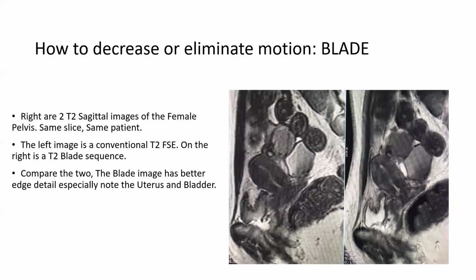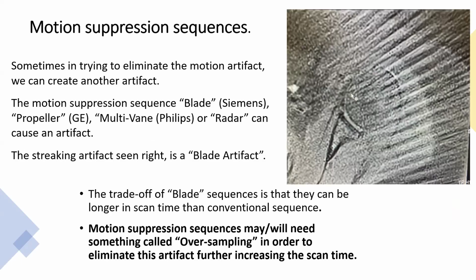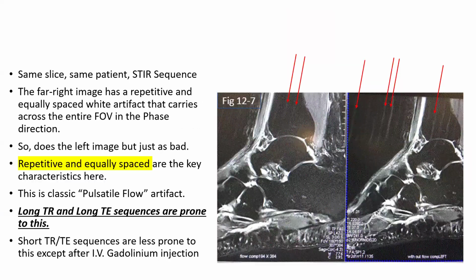All right. Some of the trade-offs for radial scanning is higher RF, because you're overlapping, you're repeating a lot of the lines of k-space. So there's more RF. Here's a blade artifact. Maybe you guys have seen this before, maybe you haven't, but you can see all those lines are pointing towards the center of k-space. Okay, and that's called blade artifact.